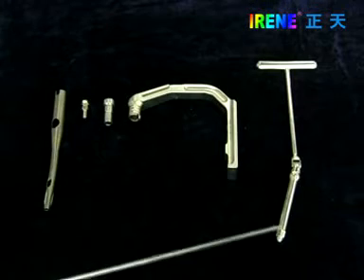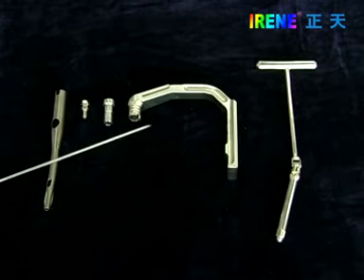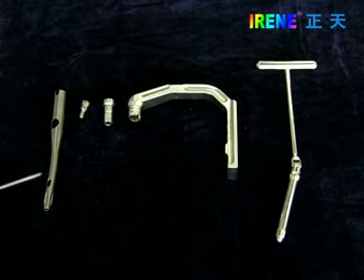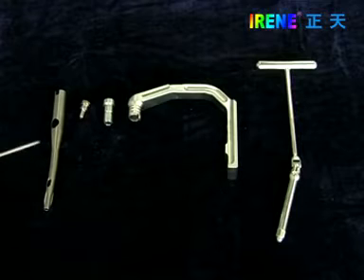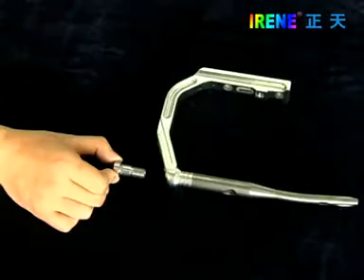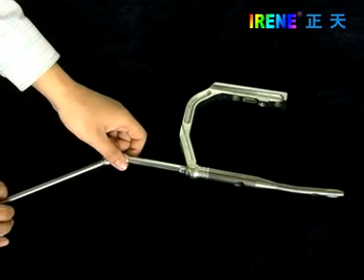These are the polyaxial hex wrench, insertion handle, connecting bolt, end cap, and PFNA nail. Connect the nail and insertion handle as shown, using the polyaxial hex wrench for fastening.